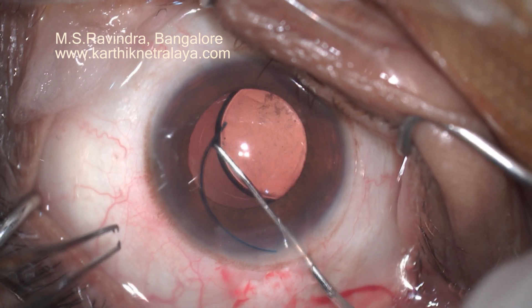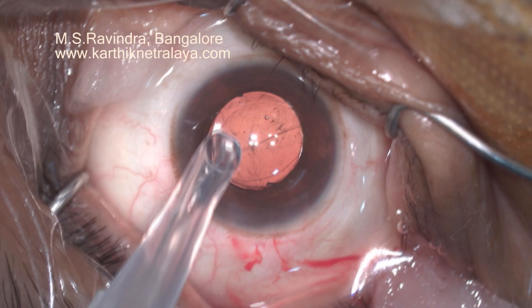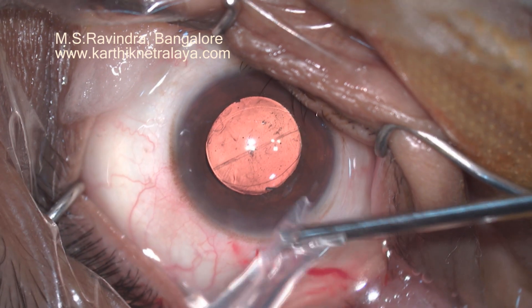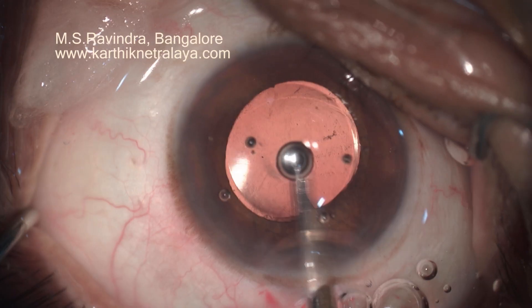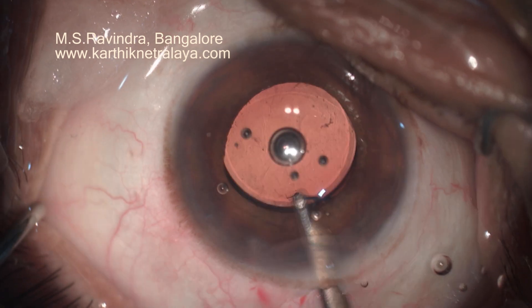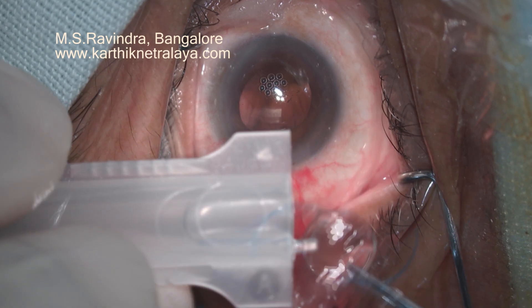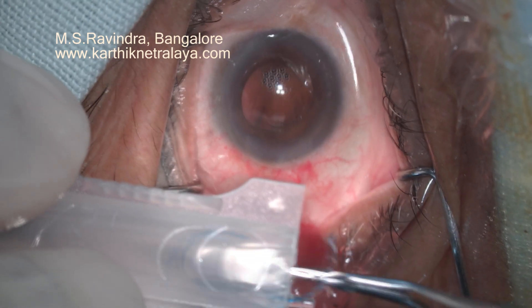The hand is pronated as it goes inside so that the trailing haptic is also in its normal configuration. The cartridge is flicked on the top to facilitate an atraumatic injection of the lens. The haptic has to be straight inside.